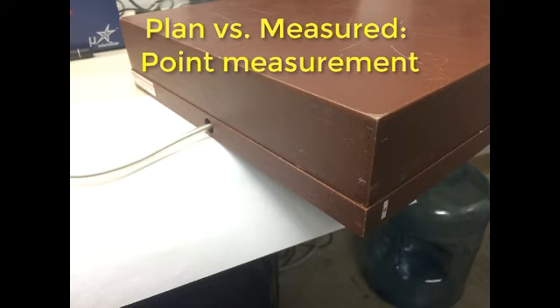So there are many different ways you can do a phantom measurement. Here I'm showing just a way you would measure with a chamber. This is a Farmer chamber. You could pick a smaller chamber if you wanted. You could set it up under different depths, different conditions, and you get a planned versus a measured dose at a point where the chamber is. There are other ways to do it as well.